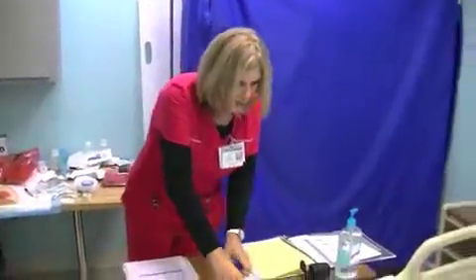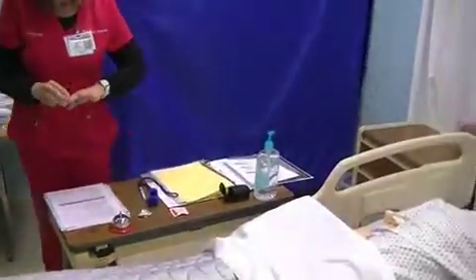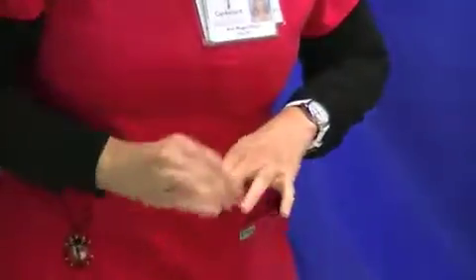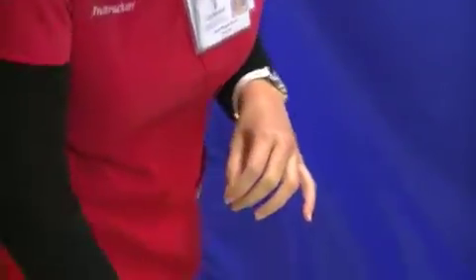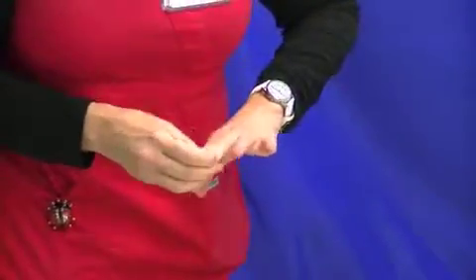I'm going to first start out by cleaning the patient's finger. When I clean the finger, I want to make sure it dries thoroughly, because we want to prevent the spread of microorganisms. Also, it helps remove moisture, and we want to make sure we remove any nail polish, because if the patient has nail polish on, it may interfere with the reading.